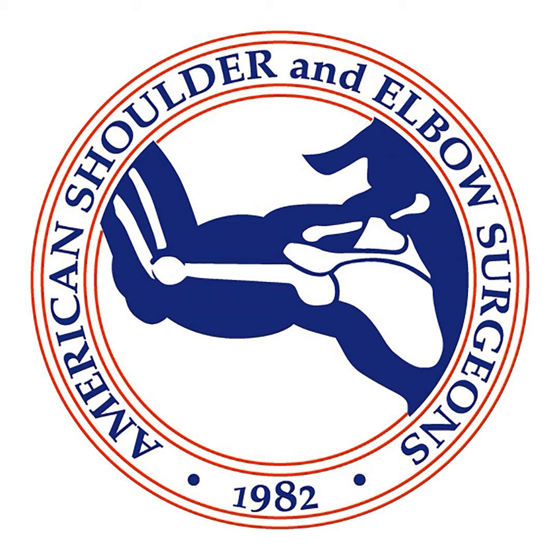You have to be careful, because using a stemless implant can complicate an LTO. You've got to be careful not to take too much bone. It's not difficult to get too aggressive with your osteotome and go too deep or too broad, and that can potentially compromise fixation of a stemless implant. So you really have to take a thin piece of the tuberosity. I will use bone tunnels through the base of the bicipital groove, and then pass the sutures through the osteotomized neck of the humerus. The stemless implant I use has a collar with holes, so I'll pass the sutures through the holes of the implant so that I'm not relying solely on bone tunnels.